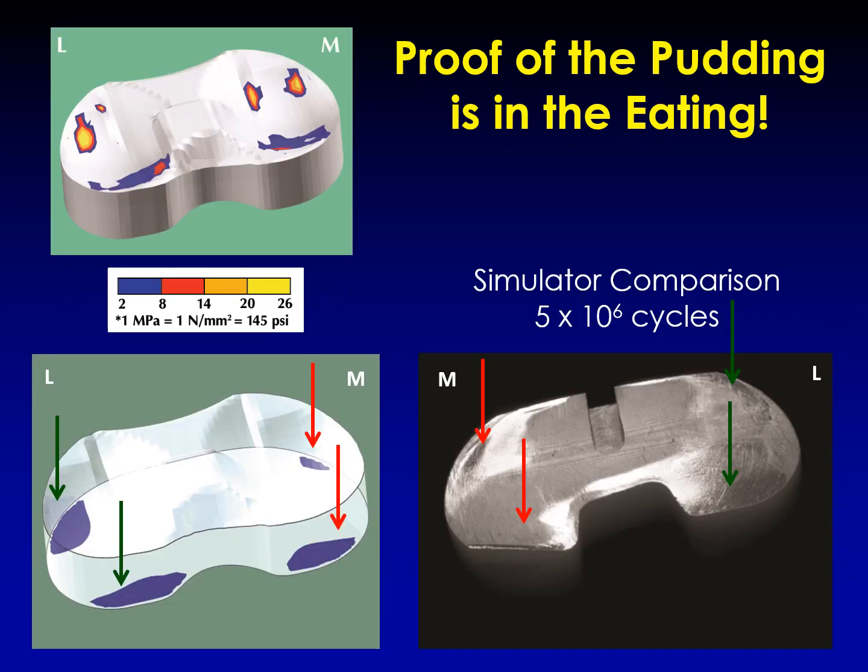An example of the consequence of poor fit between the femoral component and the proximal surface of a mobile bearing plateau as predicted by its finite element model is displayed. The poor proximal fit propagates to the distal interface, creating contact patterns along the edge. The amplifying effect of prescribed kinematics in a laboratory wear simulation specimen can be appreciated in this photograph from Walker of the distal surface of the same design. Comparison indicates that the finite element model is capable of accurately predicting locations of abrasion.